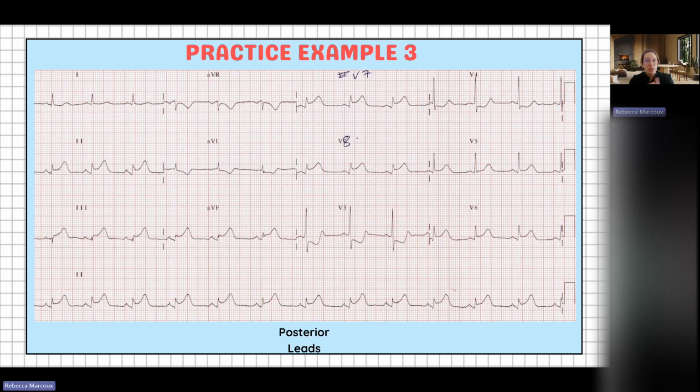So the clinician agreed and he did, first, I've never seen it done like this, but this is what I could find. So they did V7, V8. So V7 and V8 are here for some reason. What do we see in V7, V8?